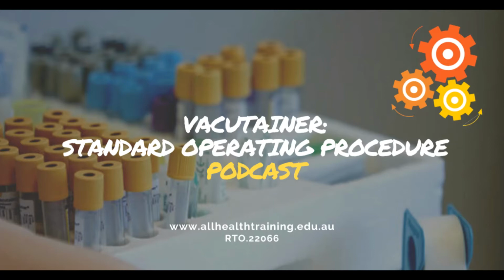Perform your 40 to 60 second hand wash. Call in your next patient, greet them in a friendly manner and tell them your name. Ask them for their referral and Medicare card. Once you have briefly looked at what tests the doctor has requested, ask them if they are happy to continue.